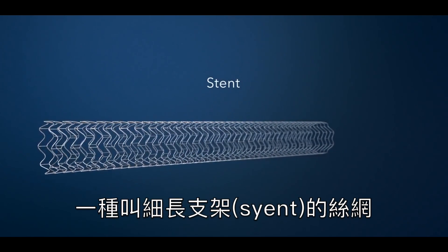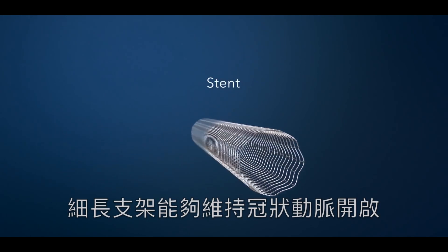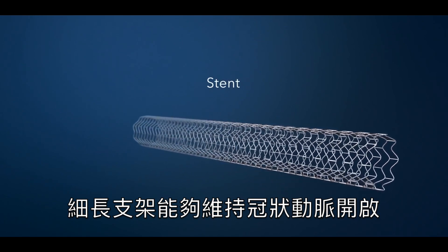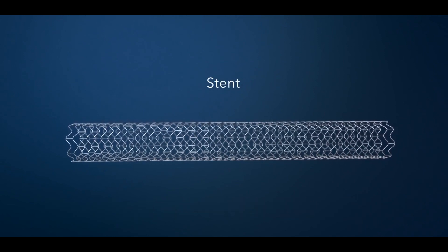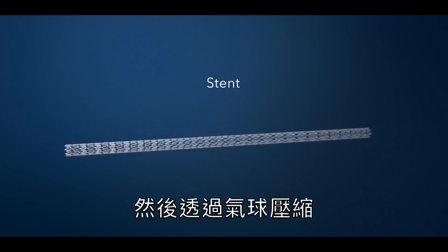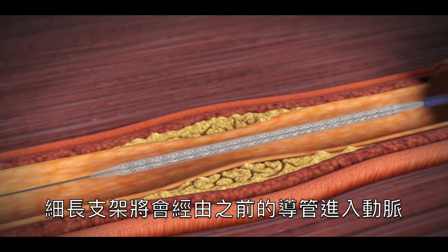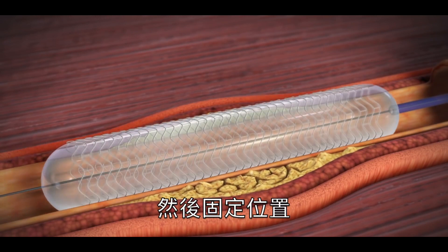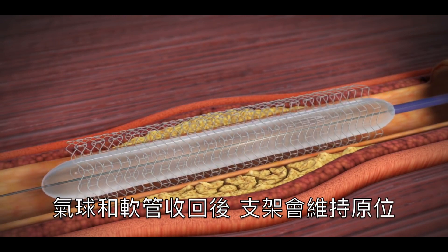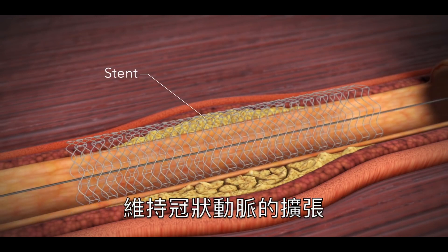A wire mesh tube called a stent may be placed in the treated area. The stent helps keep the coronary artery open. Your doctor will choose the proper size stent, which is compressed over a balloon. The stent will be moved into the artery over the same guide wire. When the balloon is inflated, the stent will expand and lock into place. After the balloon catheter is taken out, the stent will stay in place to hold the artery open.